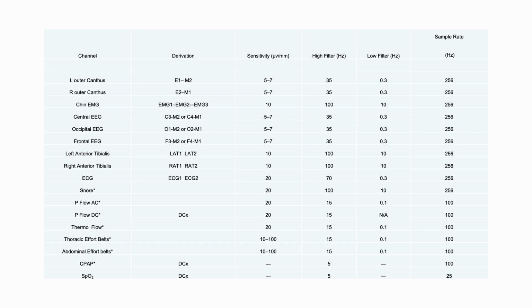When I was studying this stuff, I didn't really understand filters very well, so I would order the low frequency filters and remember the order of the equipment channels and actually memorize it in that order. But now, because I'm so familiar with this kind of stuff, I don't really have to remember it. I just know and remember what it means and how it works because I know what it does.